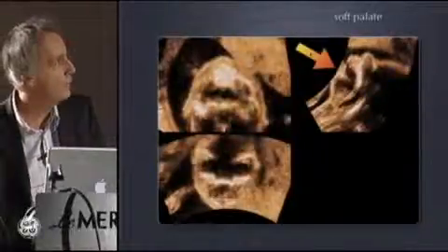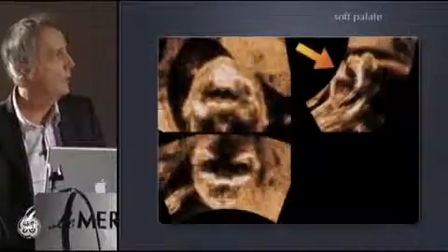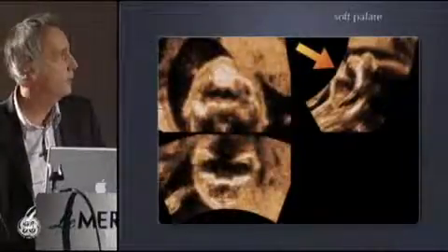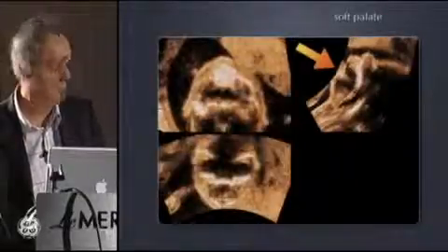The acquisition, you have to do it from here. If you do this acquisition, you move inside the block and you can clearly see the complete palate here. And this is a coronal view.